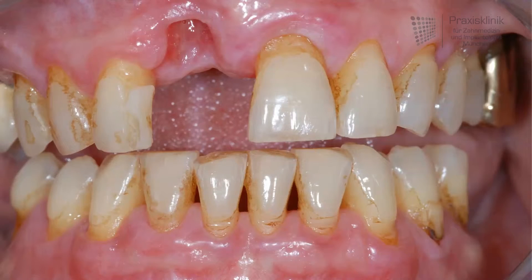The patient in this case is an older patient. As we can see there are a lot of stains on the teeth, we have ground teeth and we have a missing incisor. Before it was extracted, the missing tooth had a long history of different severe problems leading to an intense inflammatory process around the root, and as a result we have an intense loss of bone and soft tissue in the area where the tooth was extracted.